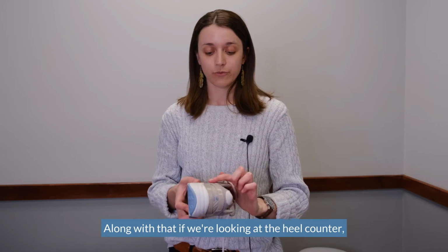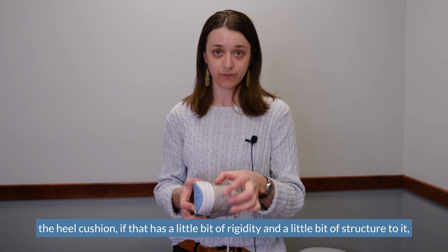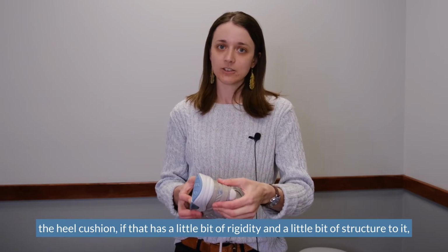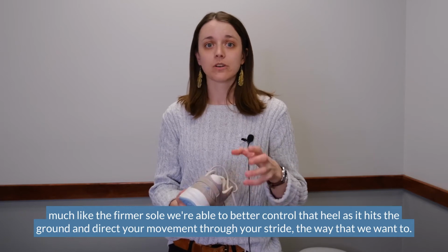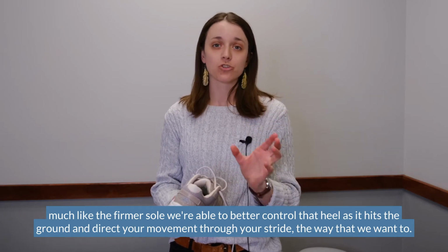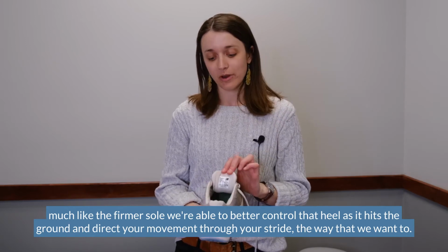Along with that, if we're looking at the heel counter, which is this piece of material just above the heel cushion, if that has a little bit of rigidity and a little bit of structure to it, much like the firmer sole, we're able to better control that heel as it hits the ground and direct your movement through your stride the way that we want to.